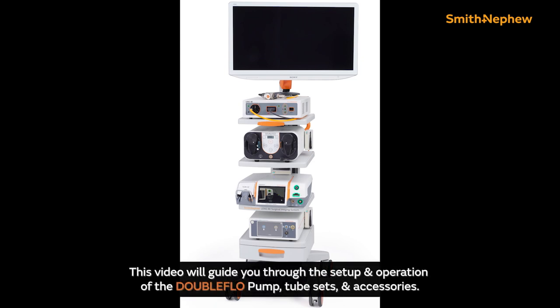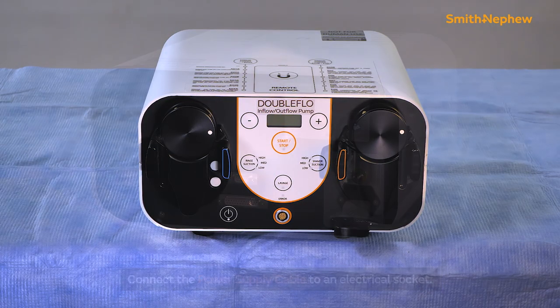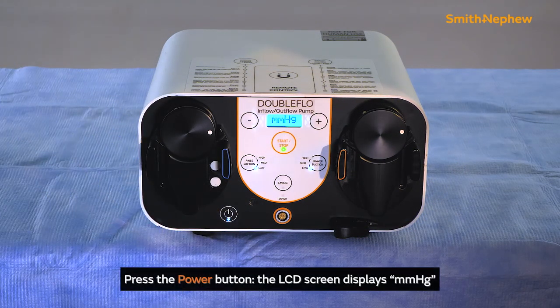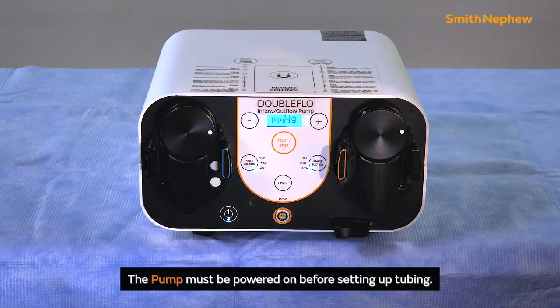This video will guide you through the setup and operation of the DOUBLEFLO pump tube sets and accessories. Place the pump on the tower at the operative joint level. Connect the power supply to an electrical socket and press the power button. The LCD screen illuminates and displays mmHg, for millimeters of mercury. The pump must be powered on before setting up tubing.